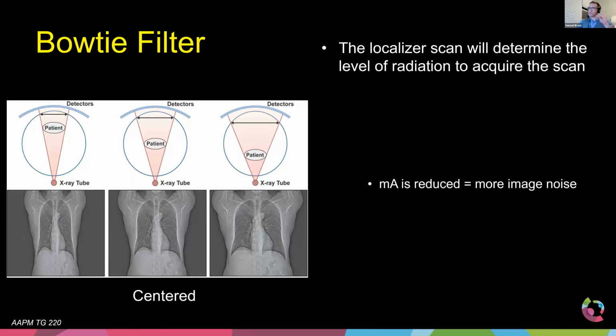If they mean by different scanning situations different clinical indications or different clinical protocols or reasons why they're scanning, then that can definitely change the CTDI value, or change the noise value to make it lower or higher. If you're doing an inherently high contrast image, such as calcium scores, or a lung image where you're looking for mets, then there's already a lot of contrast there, so you can reduce the dose. I hope that's what they were asking.